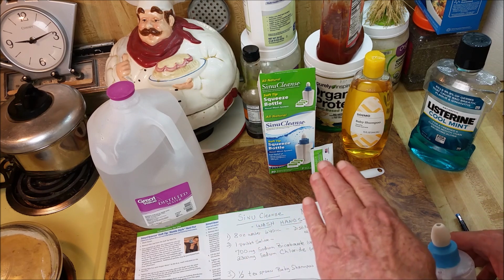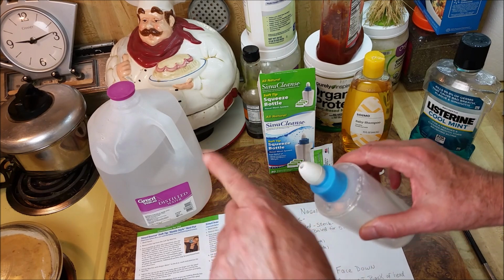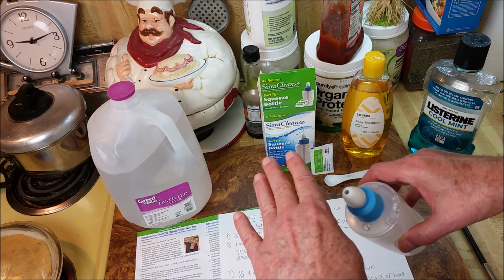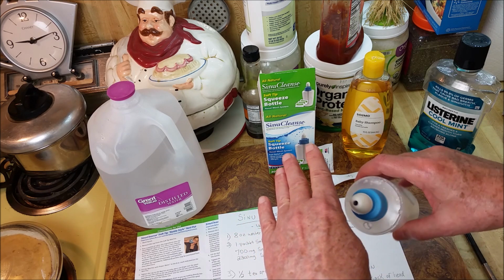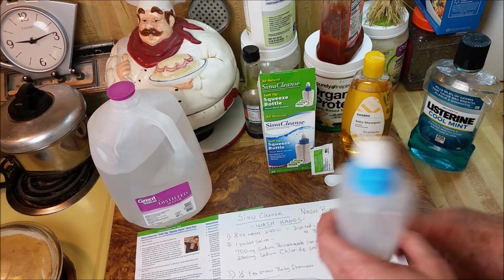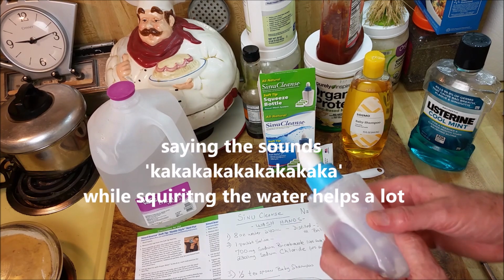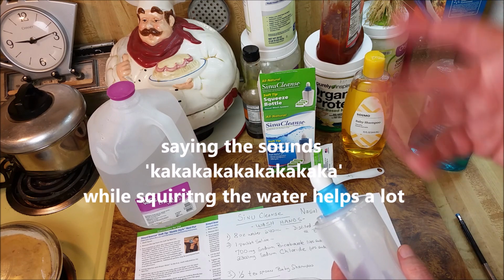So you make sure your head is facing down, and then this goes into your right nostril, and you seal it, and then you squirt. But you don't want to have it pointed toward the top of your head, you want it toward the back of your head. And then if you say the phrase or the letters K-A, ka, while you're doing it, it closes off something in your throat so the water doesn't go down the wrong way.